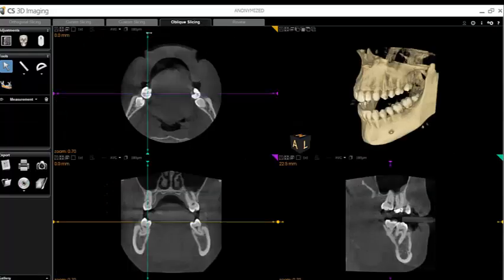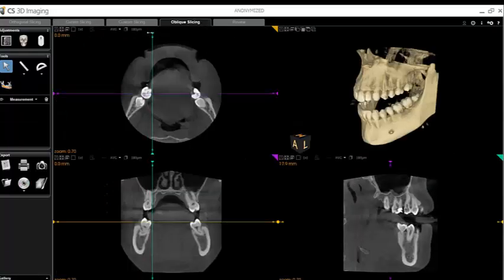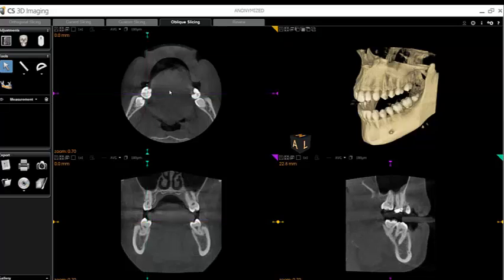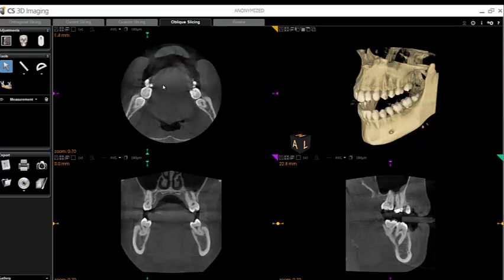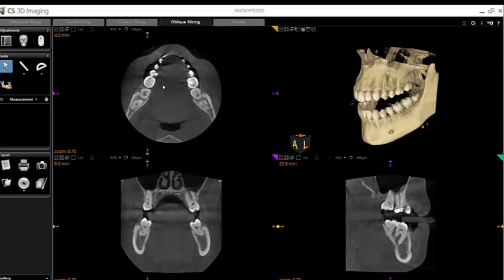Use the movement handles to center on your region of interest. Or even easier, scroll in one plane to your region of interest, and then, using your mouse's scroll wheel like a button, simply single-click the scroll wheel to center all planes on your region of interest.